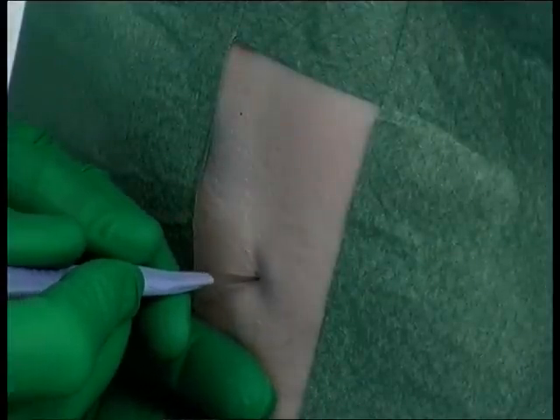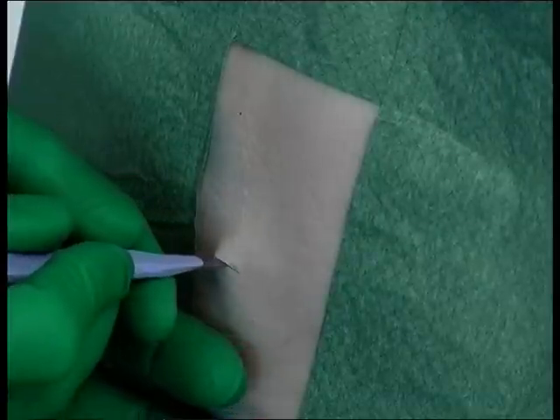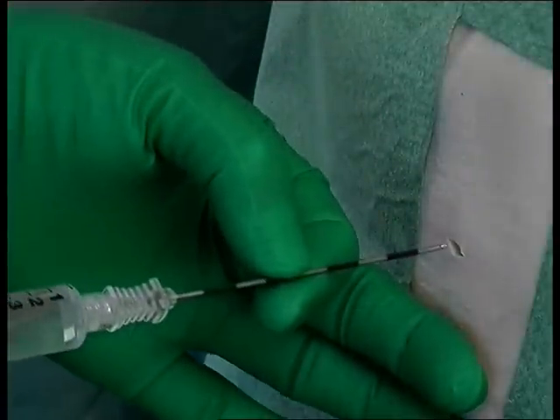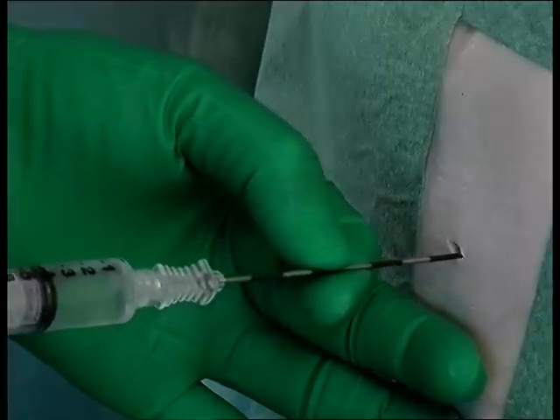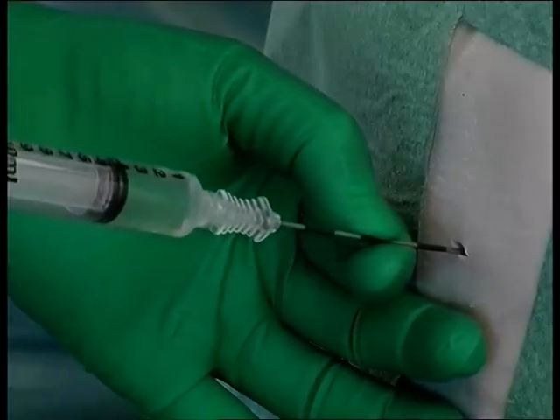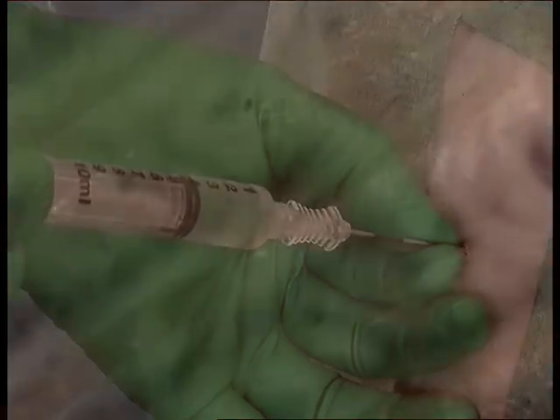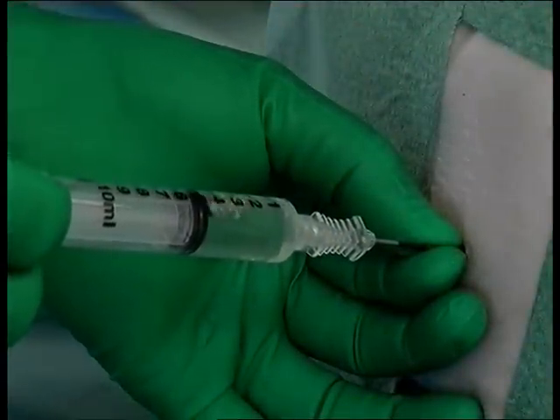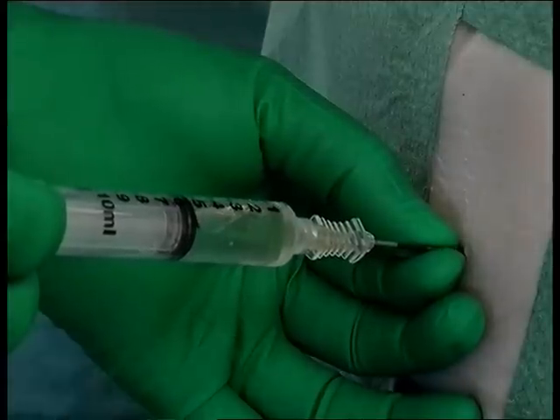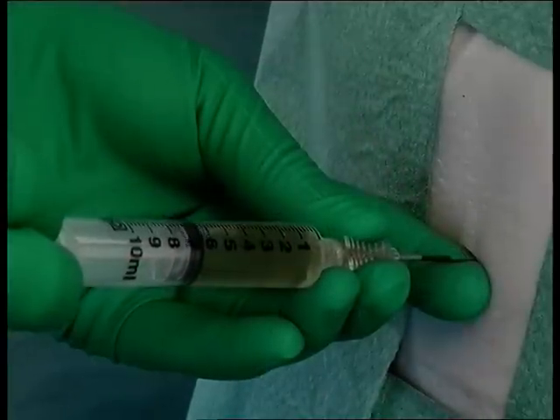Using a number 11 scalpel, make a 4 to 5 mm incision into the skin. Attach the syringe to the needle and, marking the required depth with your finger, insert the needle into the pleural space. Puncture of the parietal pleura can be sensed by a slight loss of resistance. Entry into the pleural space is confirmed by aspiration of air and/or pleural fluid.